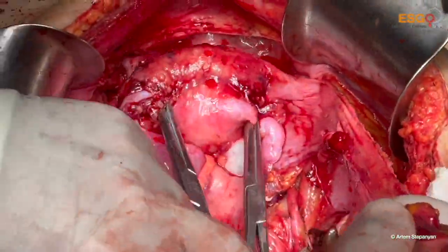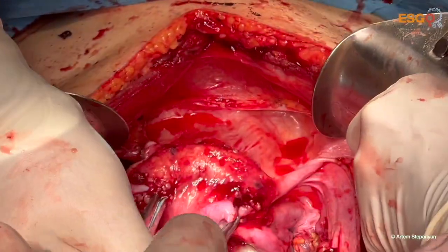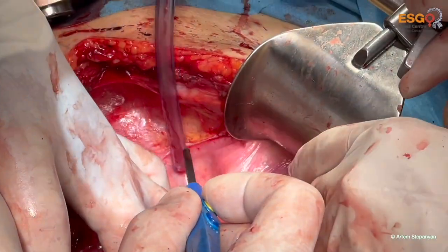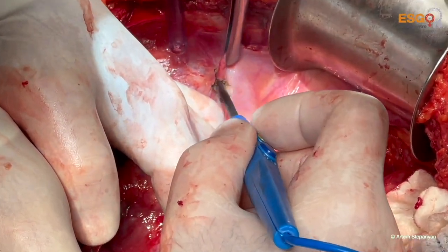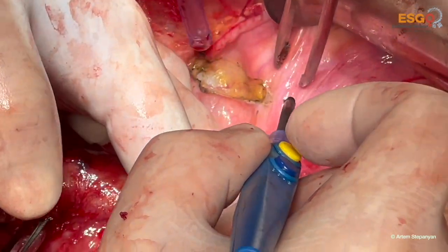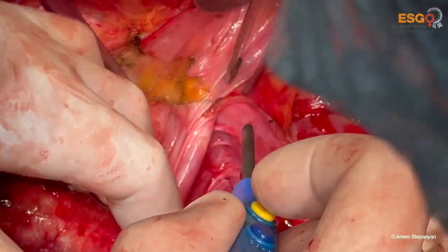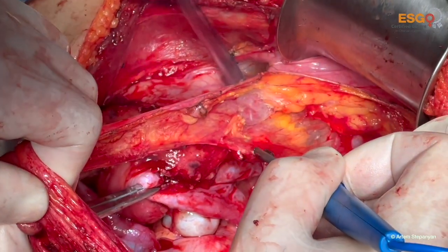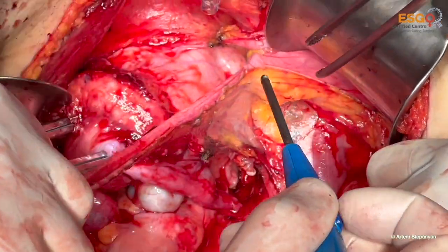It's okay, now we can partially do the right pelvic side wall. We see the round ligament of the uterus. We see the bladder peritoneum. Again, we cut the peritoneum of the right pelvic side wall. Then we will cut the round ligament and enter the pelvic side retroperitoneum.